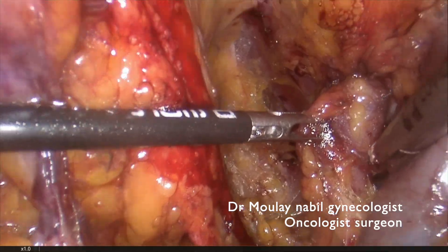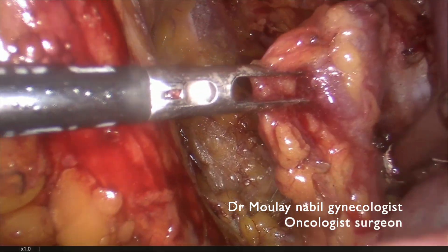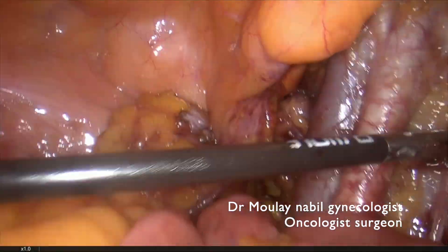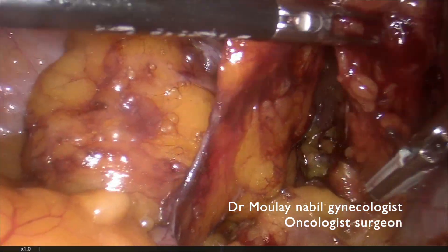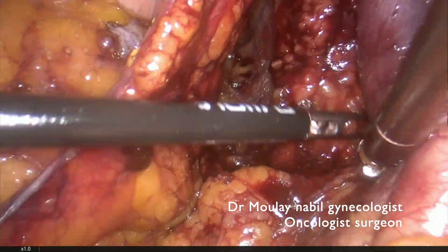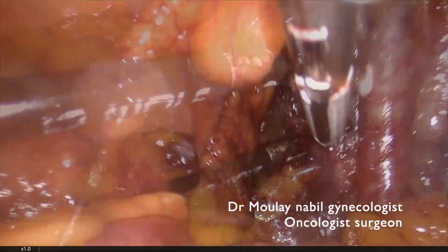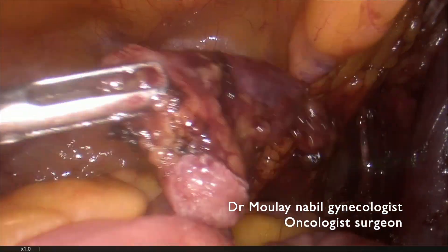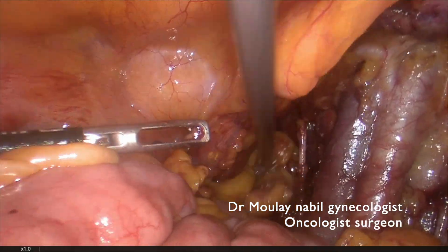When you have suspicious nodes, it's really important to ensure the hemostasis more than usual. You can see the node is between the external iliac vein and the obturator nerve. We remove all the lymphatic chain. Sometimes we have to switch to the bipolar to ensure the hemostasis, because the sealing energy is not a good tool for hemostasis when there is active bleeding.